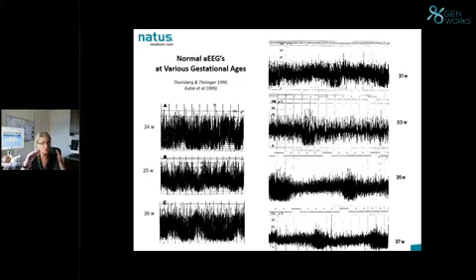There is some rudimentary or immature sleep-wake cycling that we see with that wavy pattern at the bottom, but it's mainly discontinuous. That lower margin is below 5 microvolts. But that is what we would expect to see as a normal pattern. And then as these babies mature, the background pattern becomes increasingly continuous.